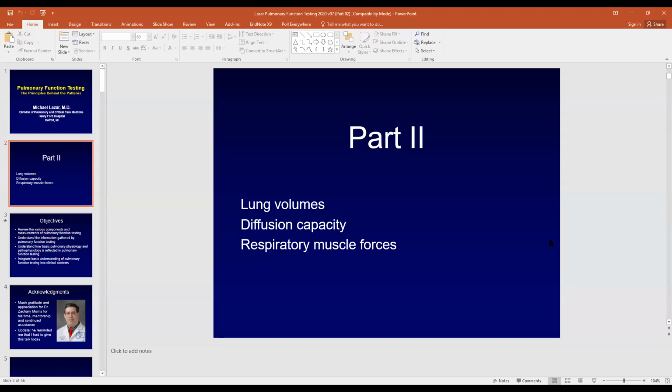Not necessarily us, but other people are going to be less able to interpret and understand what it is that they're looking at. My thought process was you're going to send that report to the patient, to different healthcare facilities or different primary care physicians, and they're going to look at the numbers. If they don't have the confidence interval, they may not understand how we came up with that conclusion.